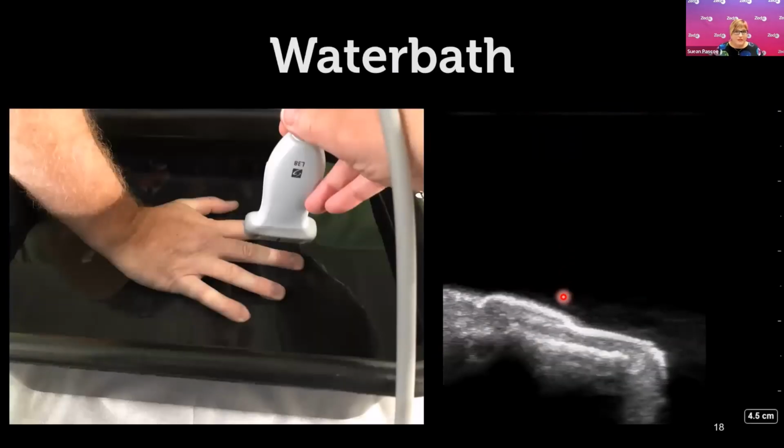My preferred method is to use a water bath technique. All you do here is fill up a big plastic bowl full of water, and then you dip the head of the transducer into the water. The water bath technique is especially useful for areas that are painful to touch because it doesn't require direct pressure from the probe on the skin. I also use this if someone's got an open wound and I'm testing for tendon integrity, if they've had a chainsaw accident or something like that.